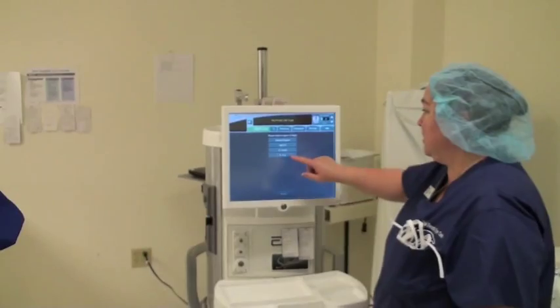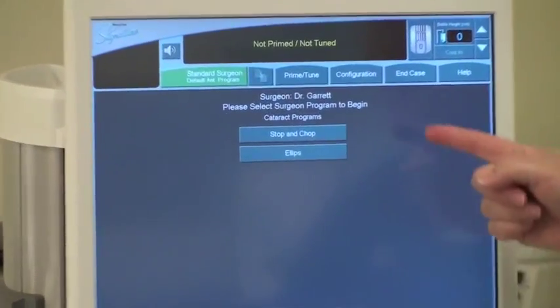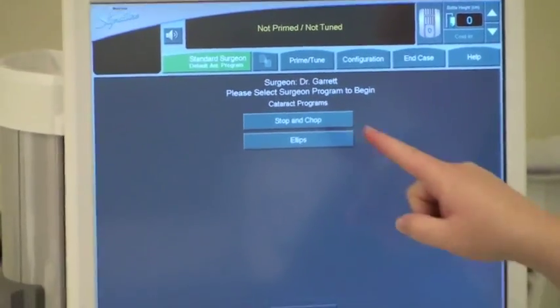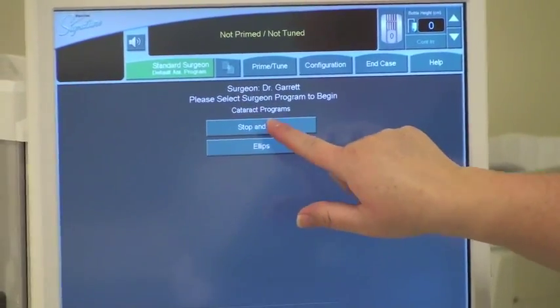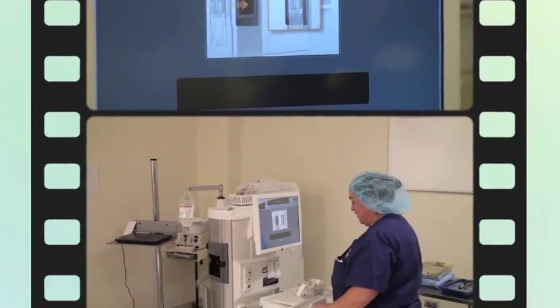For this demonstration, I'm just going to select Dr. Garrett's parameters. I clicked on the doctor, and his two programs come up. He likes stop and chop, so I'm going to select that. And then we are ready to proceed with setting up.